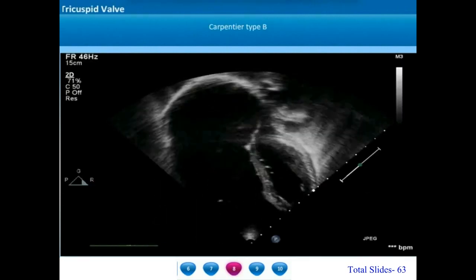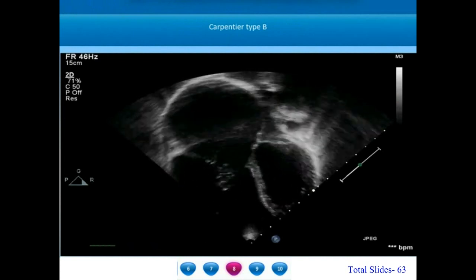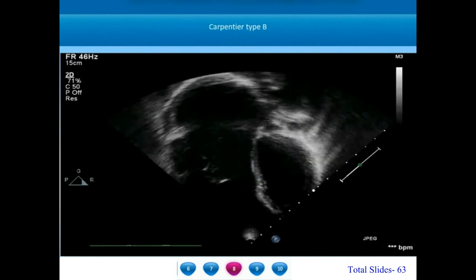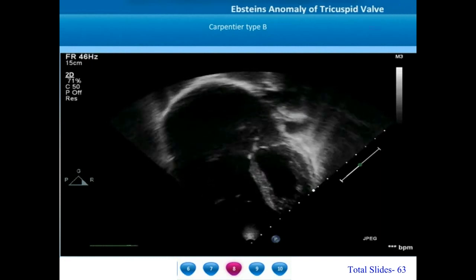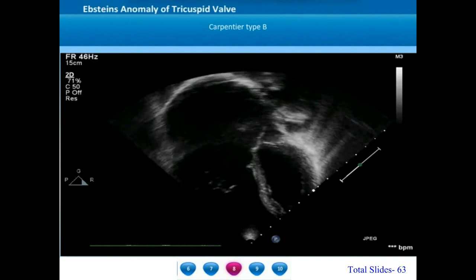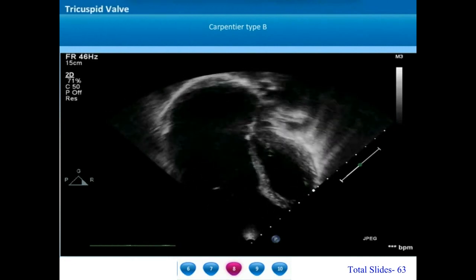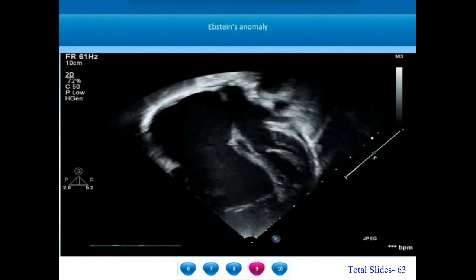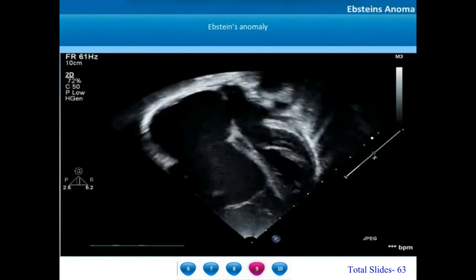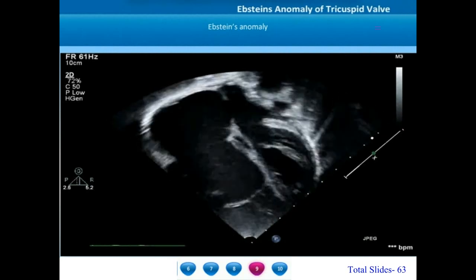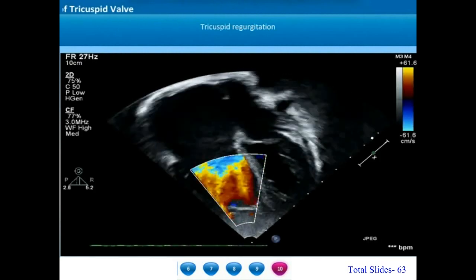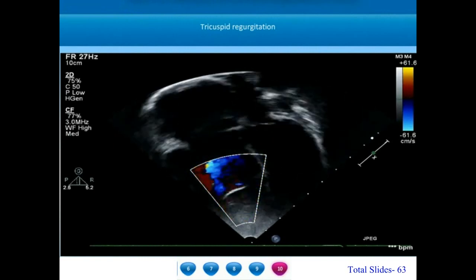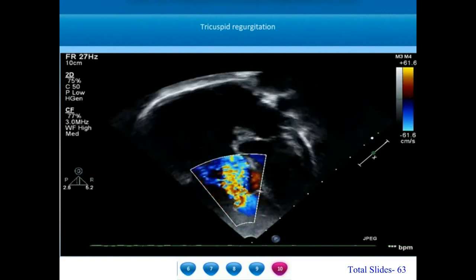Moving on to Carpentier type B Epstein's anomaly, we can find a marked tethering of the septal tricuspid leaflet. The septal tricuspid leaflet appears as a nubbin of small tissue; there is substantial displacement of the STL towards the apex. However, the anterior tricuspid leaflet is very mobile. Even though the atrialized right ventricle is quite large in this Carpentier type B, the mobility of the anterior tricuspid leaflet is well preserved. As the septal tricuspid leaflet is markedly displaced and rudimentary, coaptation is not adequate and there is moderate-to-severe tricuspid regurgitation.